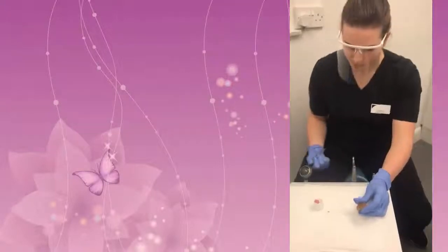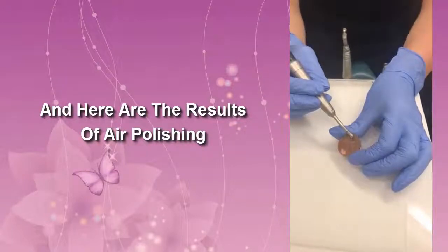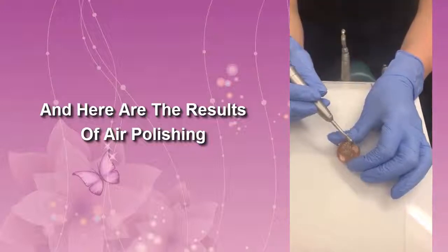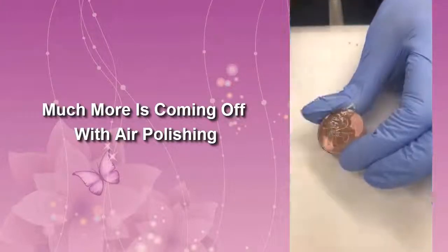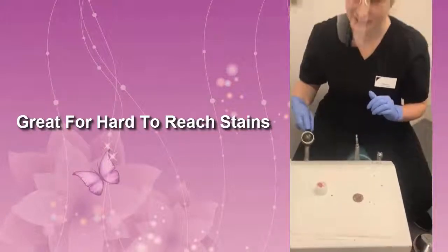So next I'll show you the results with the air polisher. As you can see, you get much more off with the air polishing than with the normal polish — definitely a good one for those hard to reach, in between the teeth stains.